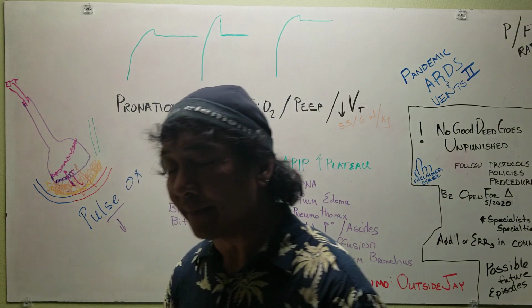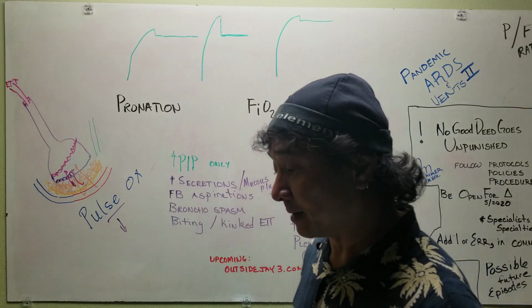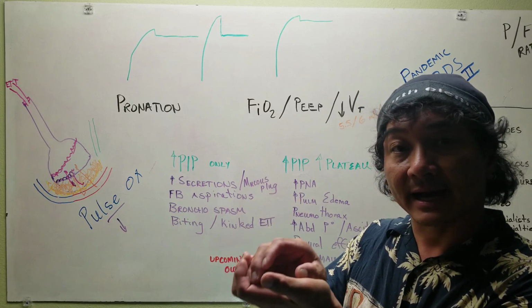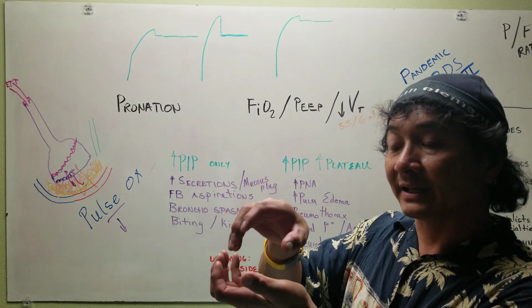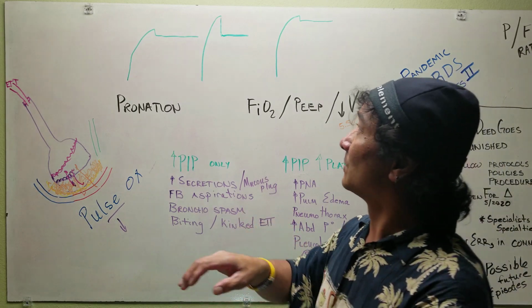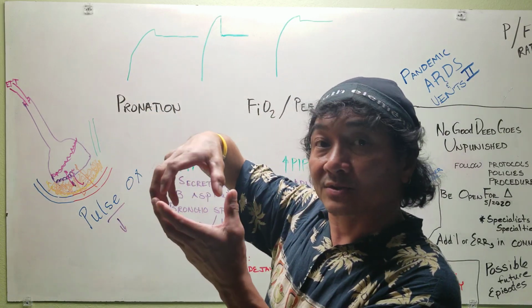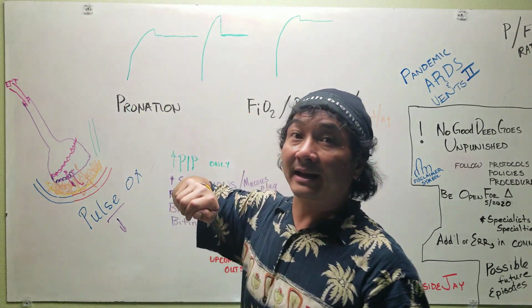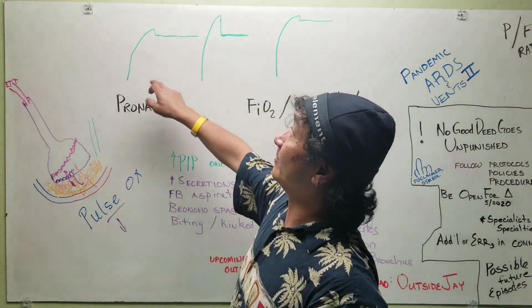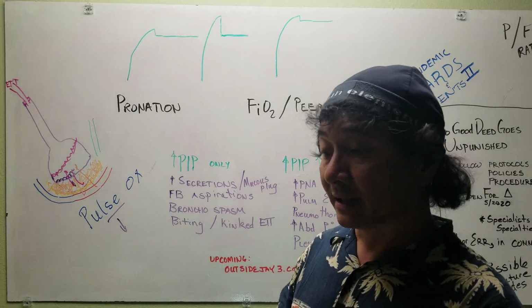So pretend I'm also pumping up a tire, a bicycle tire, with a pump. I am pumping that air inside, the tire actually inflates, and then when I stop pumping, it kind of bounces back a little bit. So this is me pumping the inflation as it goes up, and then when it bounces back a little bit, hits normal, then that's the pressure that I want to put the tire pressure gauge on, and that's my plateau pressure. While I'm pumping, I really don't care about the pressure.